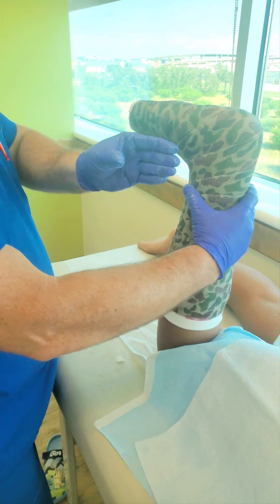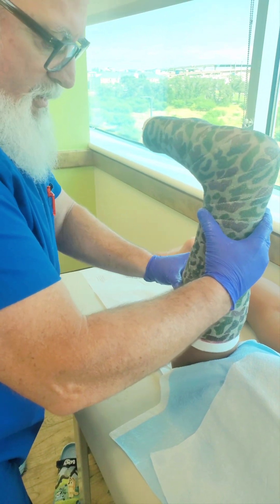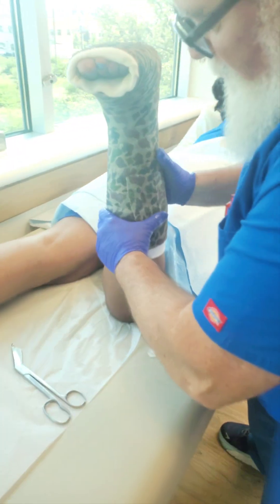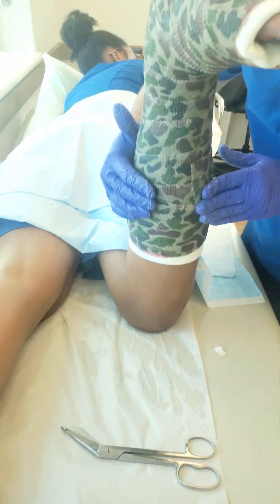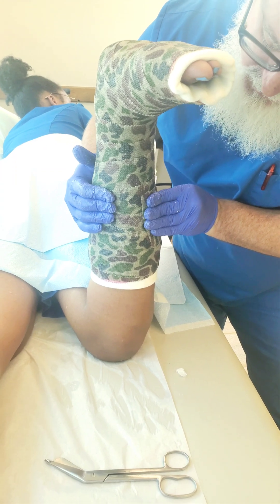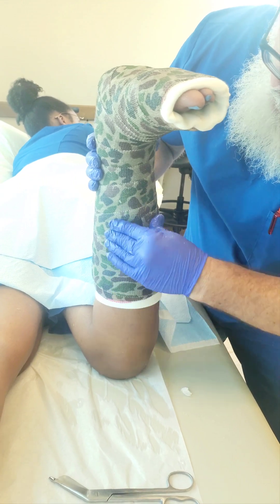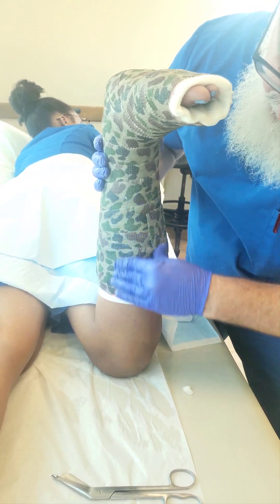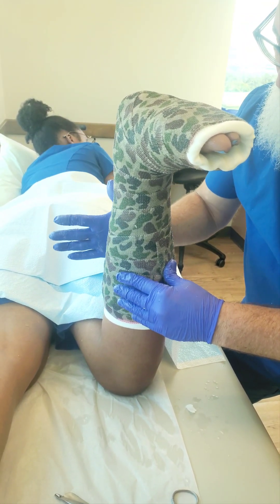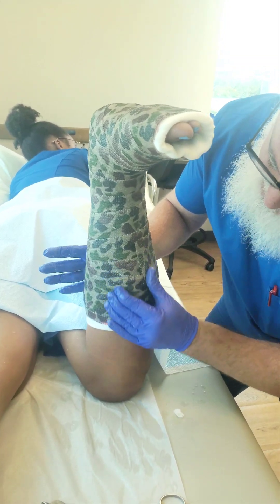When you start getting really good at your molds, you can use one hand to do the gastroc mold while the other hand makes a pyramid or triangle shape over the center tibia. You can use two hands to make that nice little pyramid shape right over the center tibia, and just like we did on the Achilles, you can use your hand to rub it into shape. If you get really good at it, you can do the gastroc mold and the pyramid mold over the tibia at the exact same time.